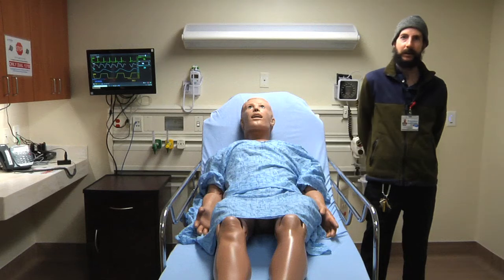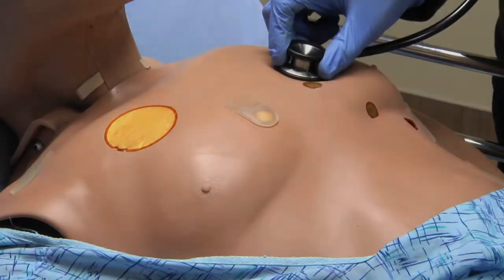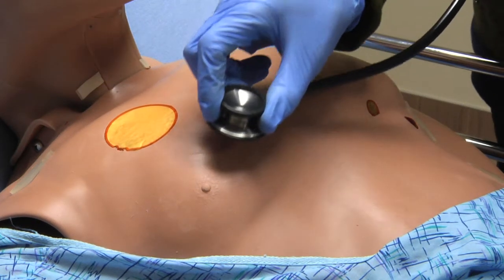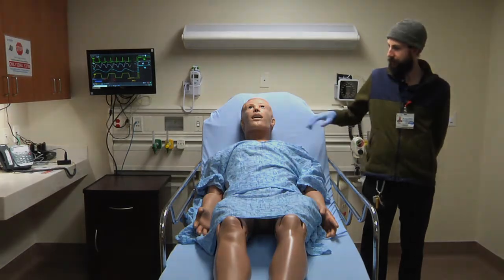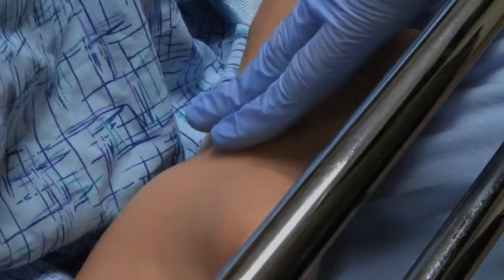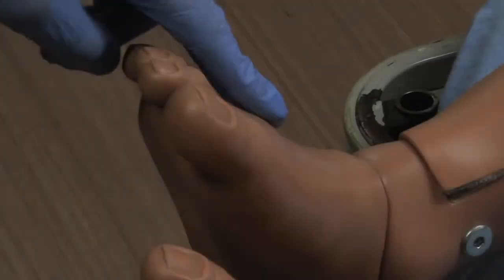So your patient today also has heart, lung, and bowel sounds that can be listened to. So an example might be wheezes. So your patient today also has pulses. So he has pulses on the carotid, on his radial, femoral, and pedipulses on his feet.